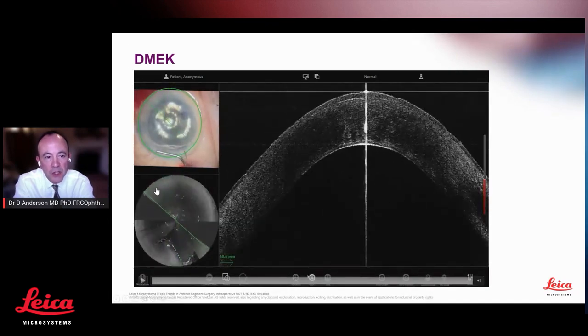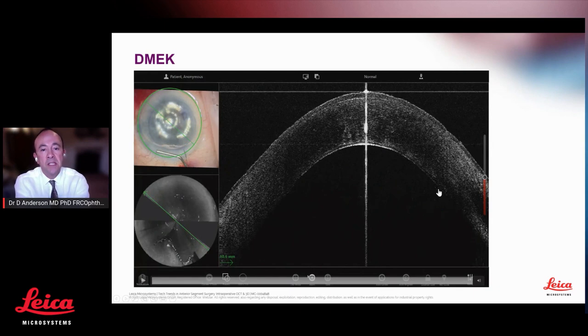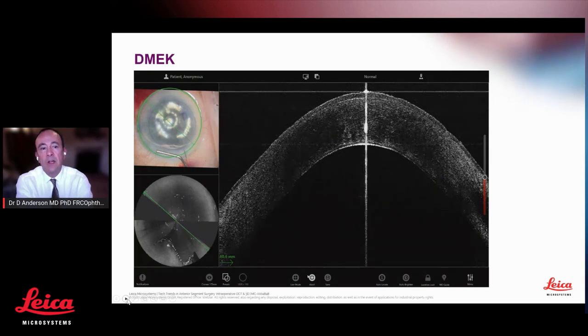And we can see that in two ways. You start to see clinically in the microscope view a much more clearly defined edge to the DMEK graft, a much more clearly defined F mark. But in the OCT view, we get a really nice clear view that the DMEK is well attached. Okay.